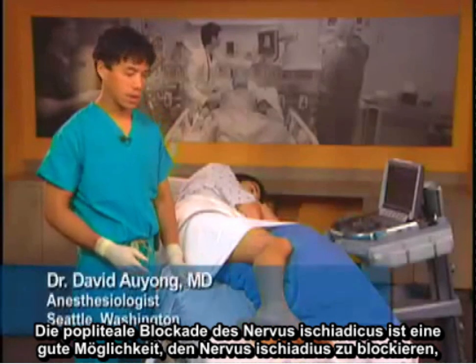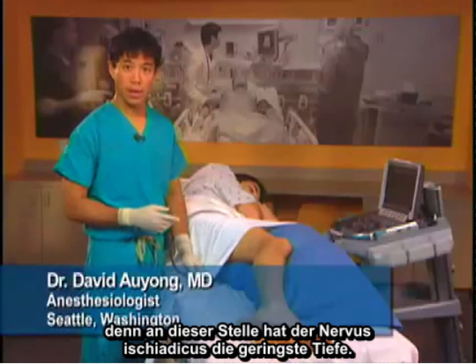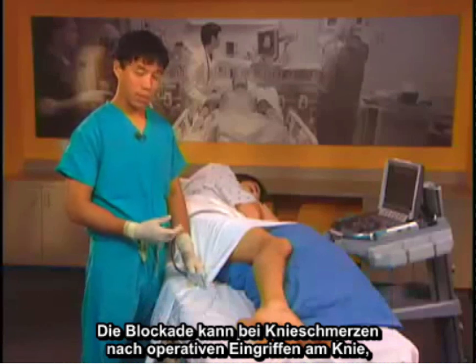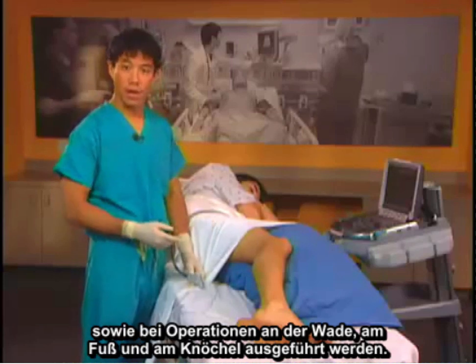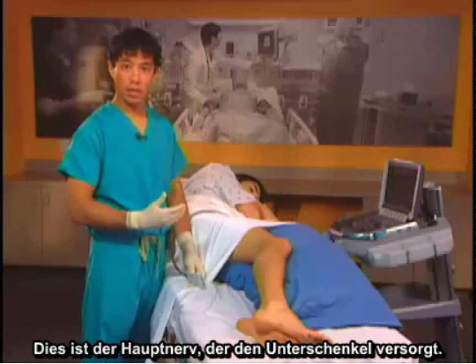The popliteal sciatic nerve block is a good block to do for the sciatic nerve because this is where the sciatic nerve is found most shallow. This block can be performed for posterior knee pain after knee surgery, as well as calf, foot, and ankle surgery. This is the main nerve that supplies the lower leg.